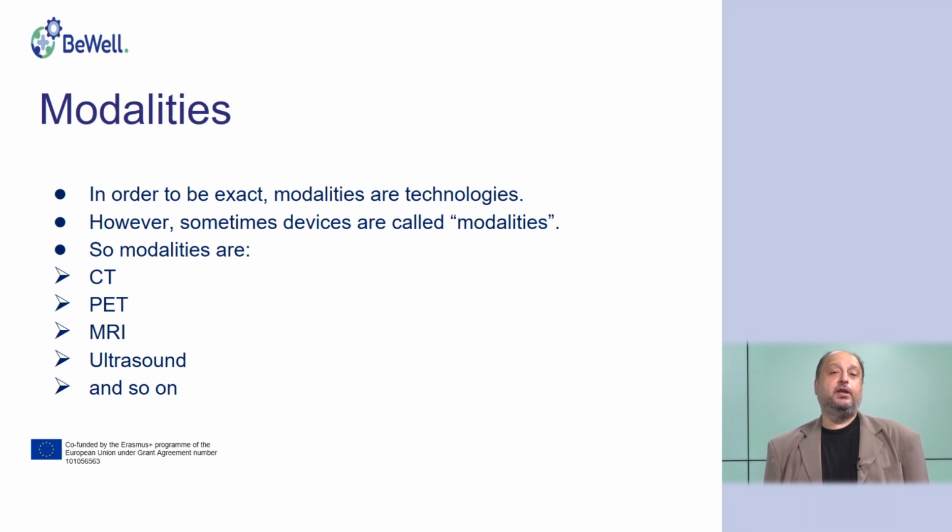So when speaking about a modality, this is the CT, computed tomography, not the computed tomography scanner. The computed tomography scanner is the device, and computed tomography is the modality. The same with positron emission tomography, magnetic resonance imaging, ultrasound, and so on.